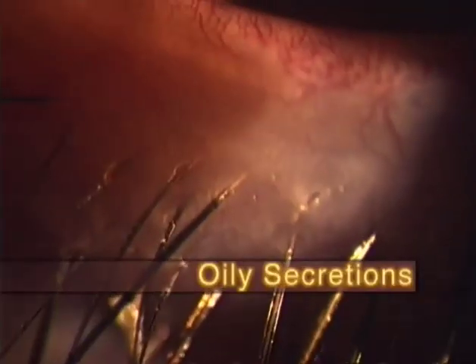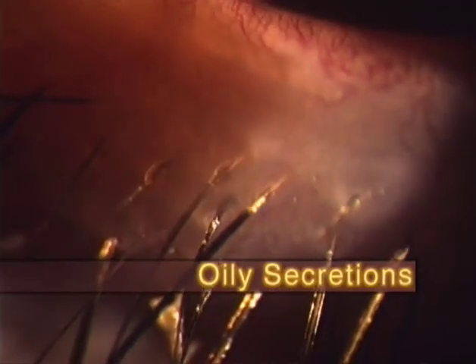If the secretions are oily fluid, their surface reflex is smooth, and in indirect illumination they are transparent. At the surface of the epithelium, they are just lubricants, but otherwise they leave no visible traces.